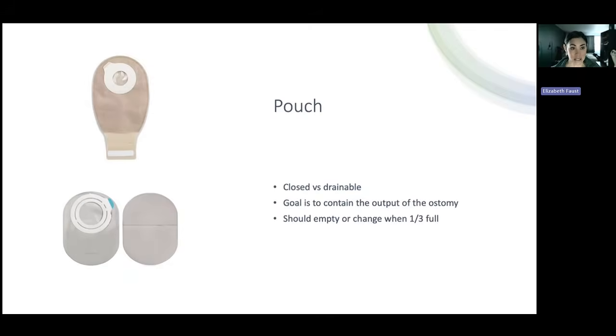For urostomies, all of the pouches have a spout bottom. So there's typically a mechanism that you would switch or push on in order to open the valve for that spout bottom. There's one that has a drop on it, and I always say when the drop is showing, then liquid is flowing. But all of the different companies have a slightly different mechanism for it.